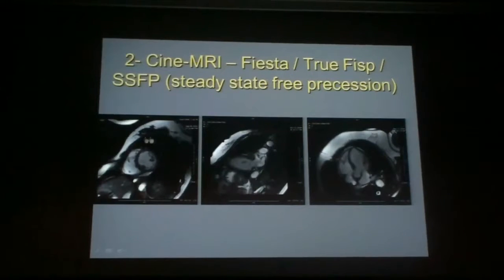So it's always very useful to analyze this thickening on a short axis, a longitudinal 2D axis, and a four-cavity axis, which give you separate information. Usually you do have an ejection fraction that is normal, around 60% of your left ventricle. We'll come back to that.